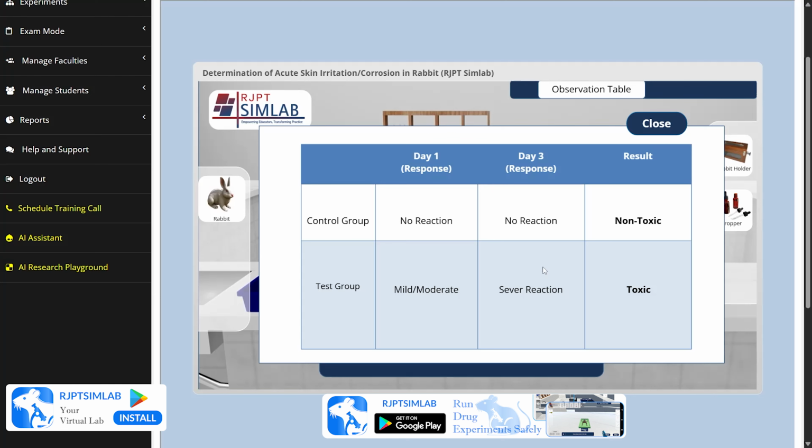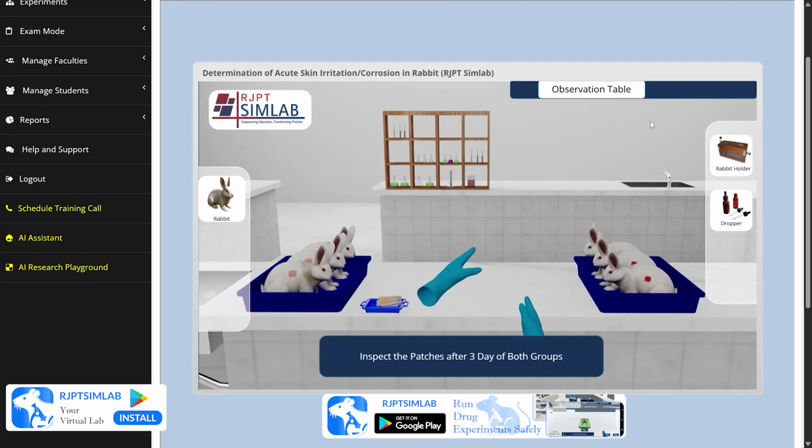So I think we have learned about the skin irritation and corrosion of a test drug in the rabbit. So now we have completed our experiment and we have come to the end of this video. I hope that you have learned a lot in this experiment about the acute skin irritation and corrosion in rabbits with a test drug.